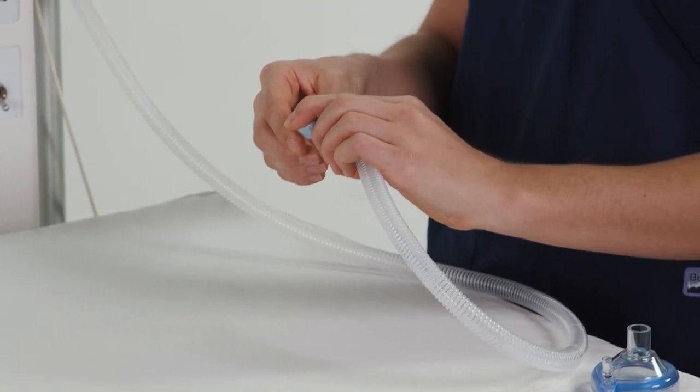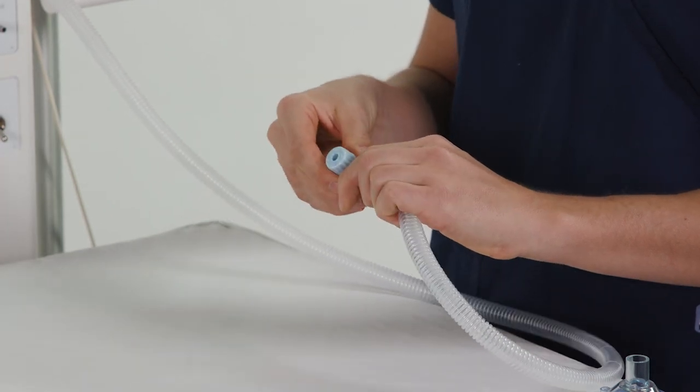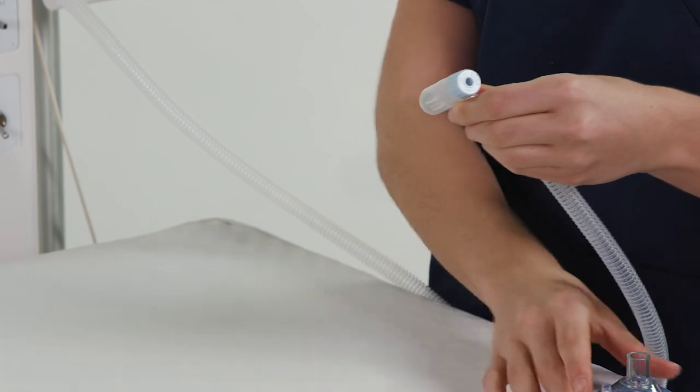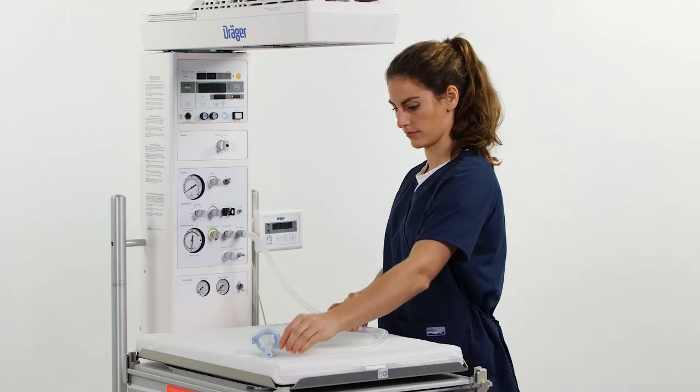Take the T-piece and occlude both the top and the bottom. Setting PEEP, occlude only the large port on the T-piece and adjust the blue knob as required to get the desired PEEP setting on the pressure gauge. Connect the mask to the T-piece.